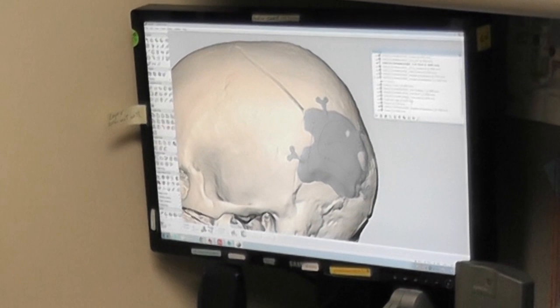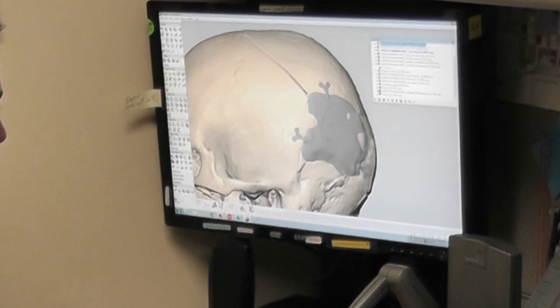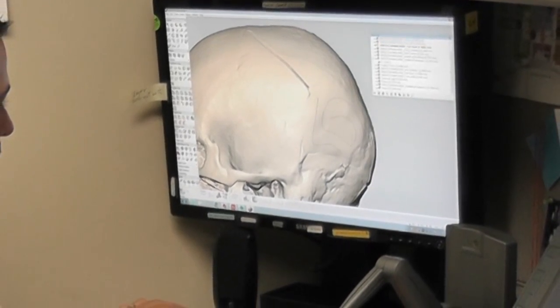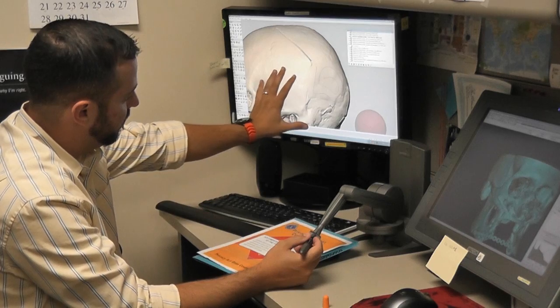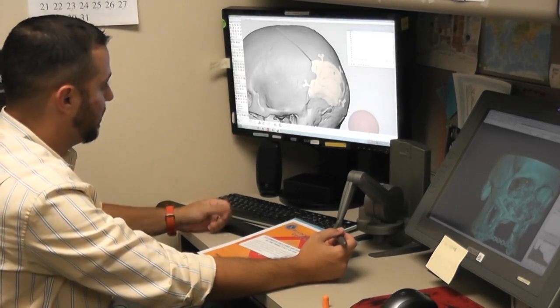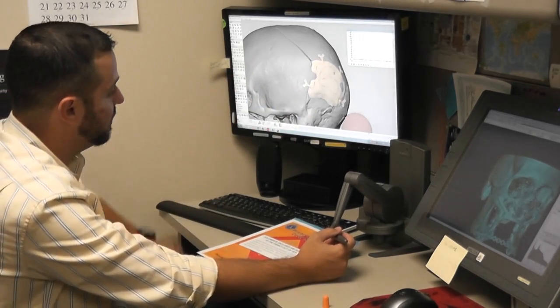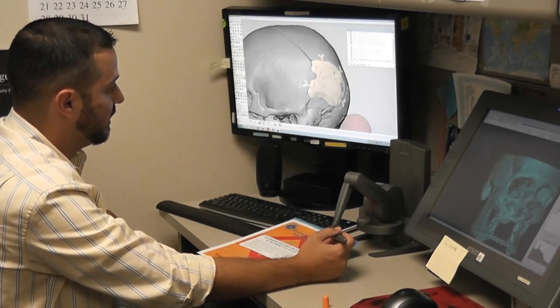Over here I actually did design an implantable part. This patient, as you can see right here, is missing a big part of his head. Here I have put back pretty much his missing part. There are a few steps that go into that — after that, we add the fixations so that it can actually be drilled into his head.